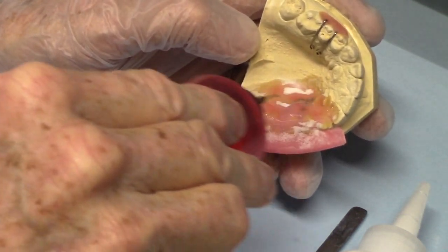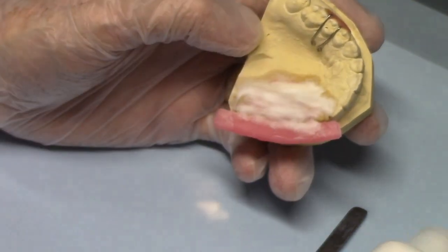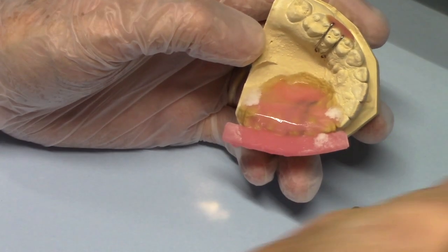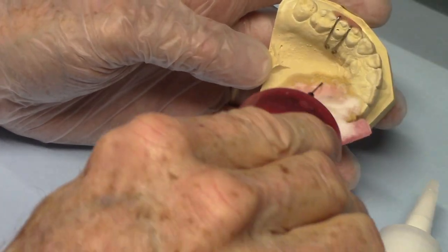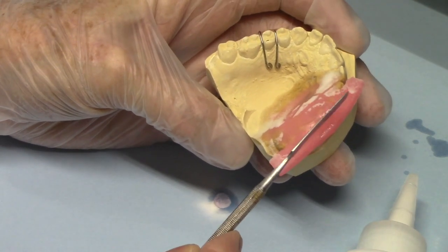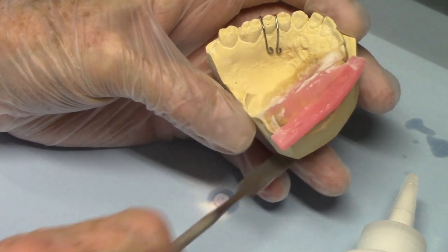Now this model, since this is just for demonstration purposes, I haven't put separator on it. It may bubble. Doesn't matter — you can see what I'm doing. You can scrape that back, and that works pretty well. But it takes a little bit of time to put that wax on.